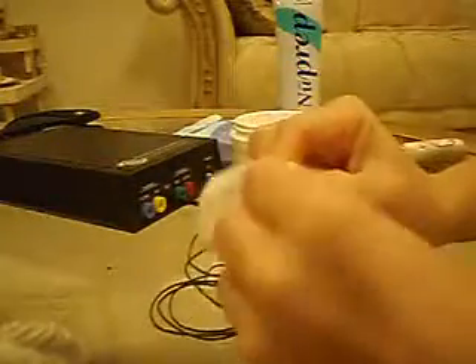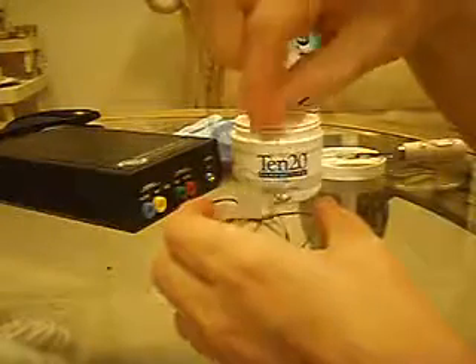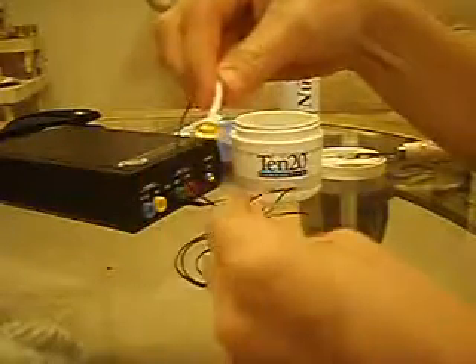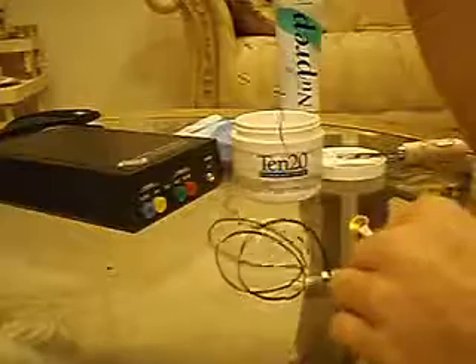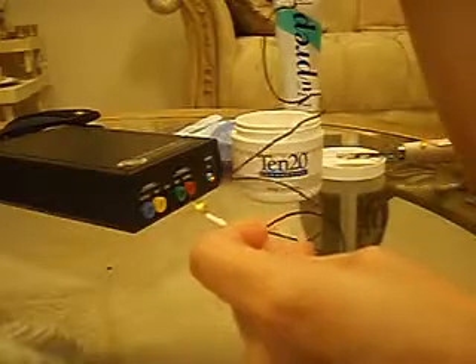If you can't get all the paste off that simple way, or if you want to clean the electrodes to a greater extent, you can also use hot water. Just get a cup of hot water, dip the electrode in and swish it around — the paste just sort of dissolves in hot water. You can also use ivory soap and rinse it under the sink. If you use any sort of water with electrodes — including electrode caps — you want to make sure you keep the connector part very dry. Keep the connector higher than the electrode so that water doesn't run down the wire and get into the connection. You may want to have a clip or hook on the wall next to your sink where you can hang it while cleaning.